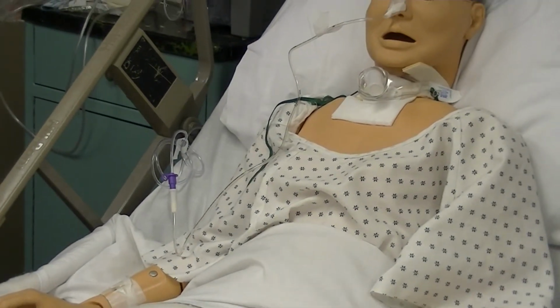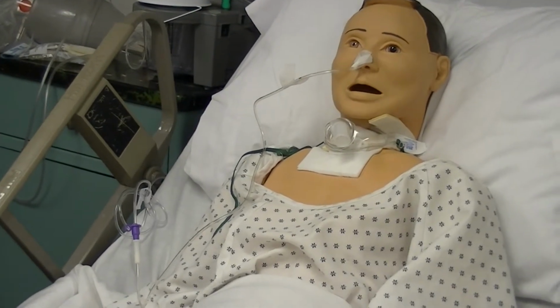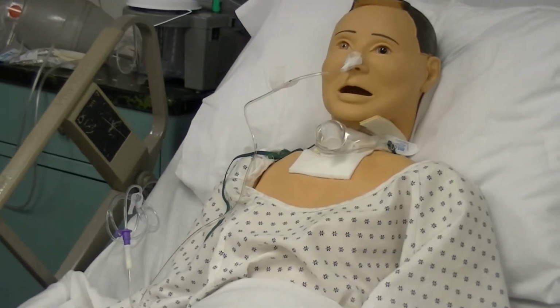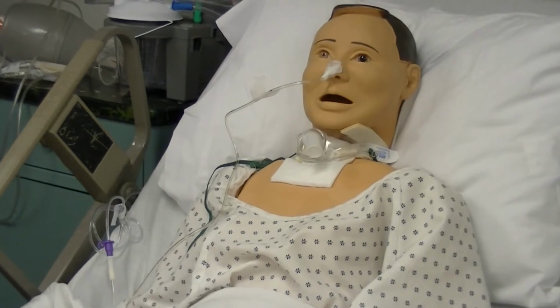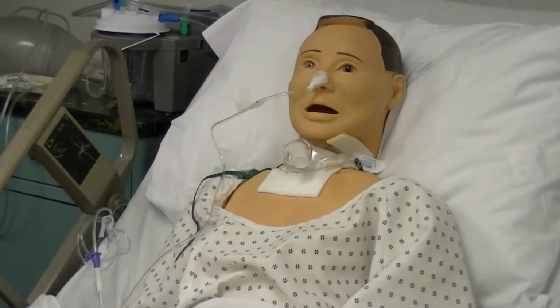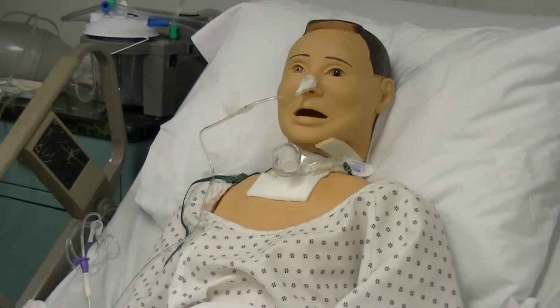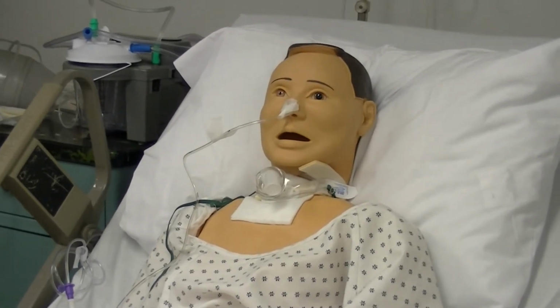Gastric contents are acidic, so the lower the number, the higher the acidity. You also need to make sure that you are verifying placement by obtaining an x-ray before any initial feedings. Make sure to anchor the tube to the face so that it does not become dislodged. And always, always, always maintain the head of bed at least 30 degrees.